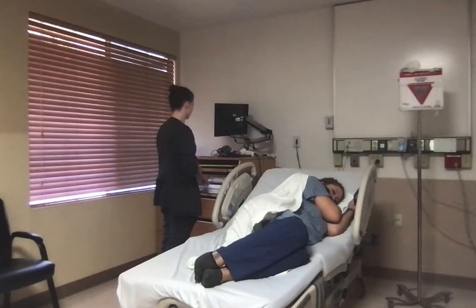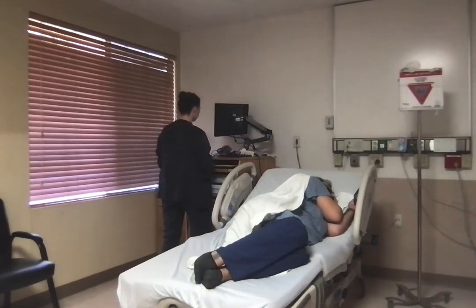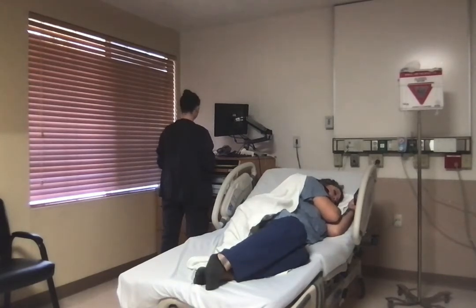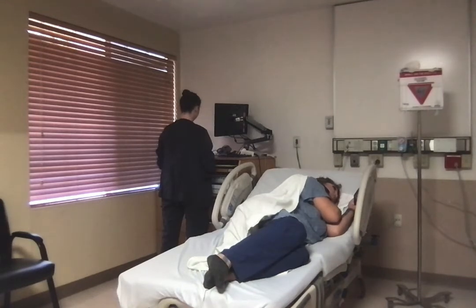Nurse Lake returned to the nurse's station and observed fetal heart rate return to baseline with moderate variability and remained absent of decels for the remainder of labor. Labor progressed as expected, and a baby boy was born vaginally at 16:56 with no complications, a 1 minute APGAR of 8 and a 5 minute APGAR of 9.